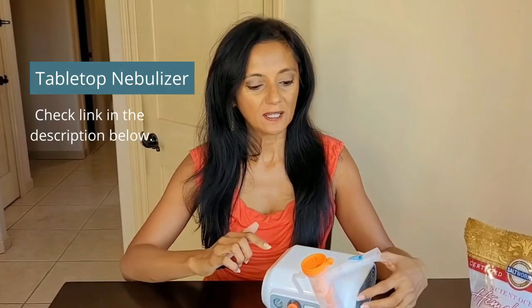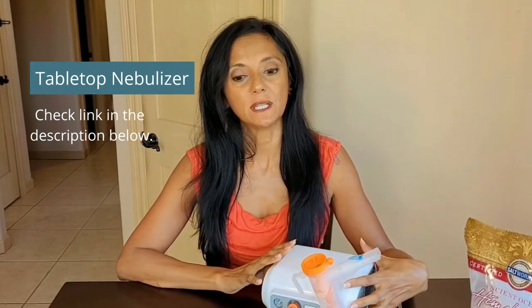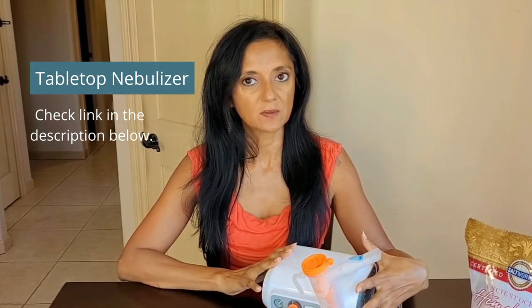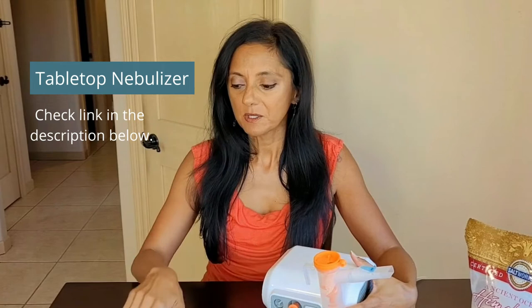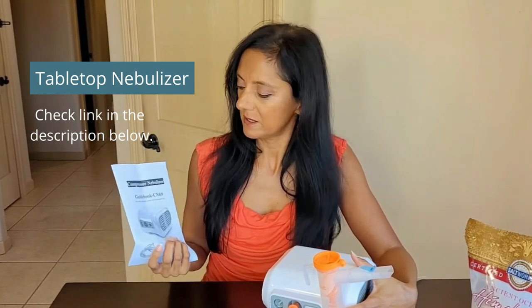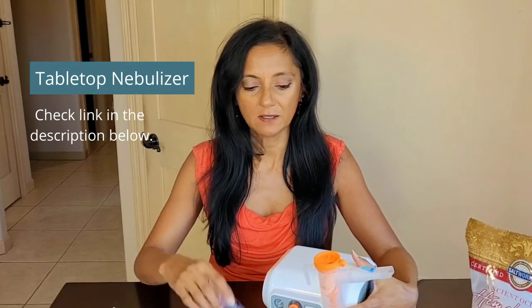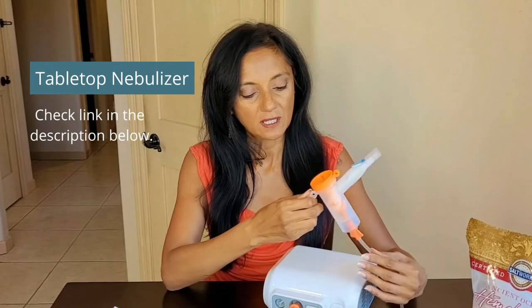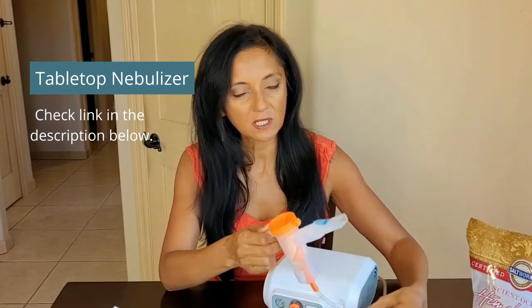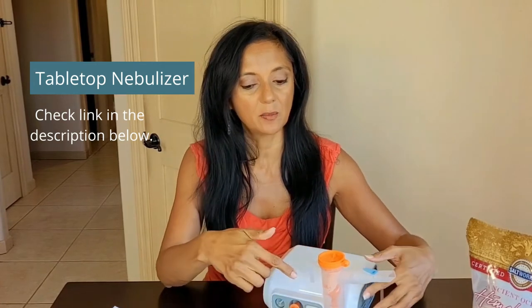The reason why I like this nebulizer — this is the desktop version — is because it's durable and it's pretty strong. From what I've read, it will last you a long time. This particular one, I believe it's a CN69, comes with the mask, both adult and child, and the mouthpiece. And what I do like is it has a clip in the back, so when you get tired during your treatment and need to rest it, you can just clip it so it stays upright.